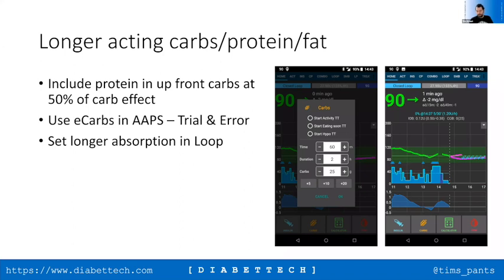What I generally do, as I mentioned, is I bolus and then leave UAM to deal with the carbs, because that works for me. But if you do need to enter them, that's how you would adjust the insulin in Android APS's bolus calculator.